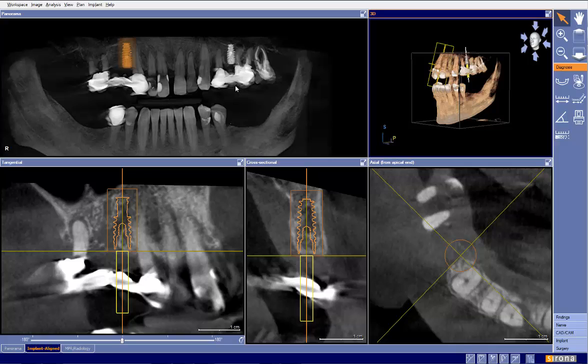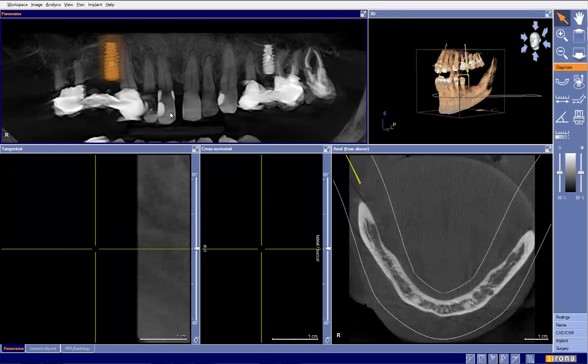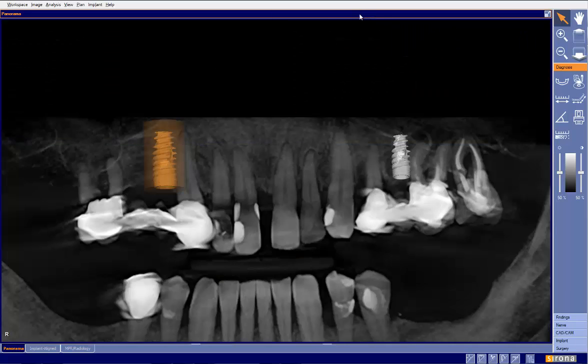And the question is, we'd like to save the anterior terminal abutments on these, let's call this number 6 and number 12. And the submitter would like to save those teeth. The treatment plan right now is for an implant retained overpartial, with the potential of going down the road to a fixed prosthesis.